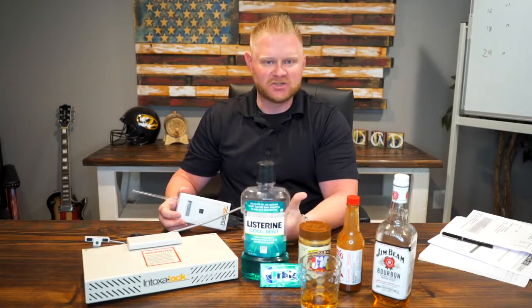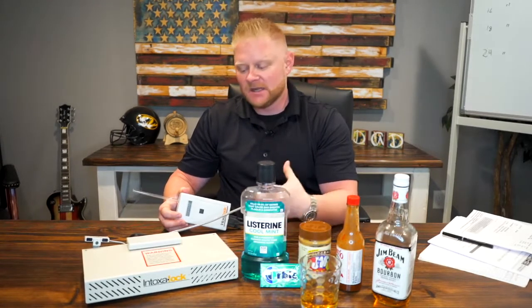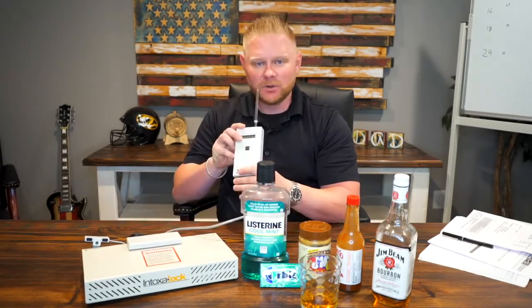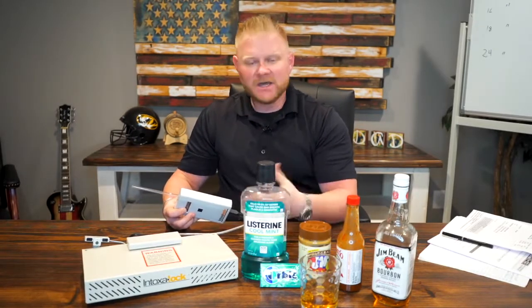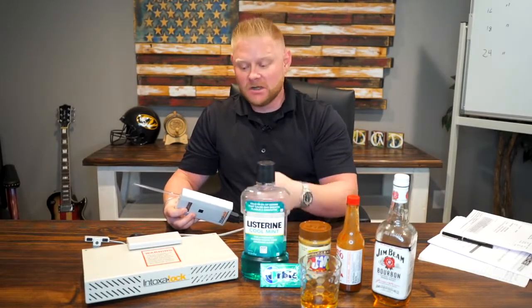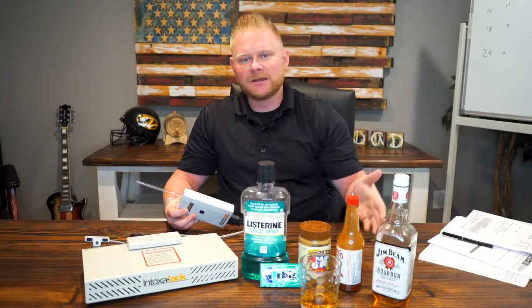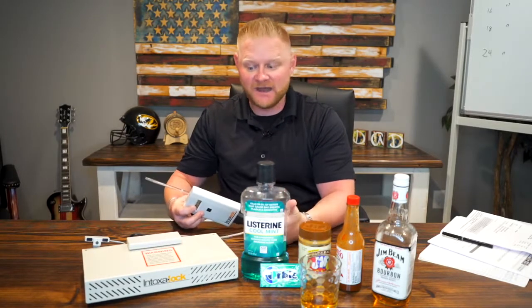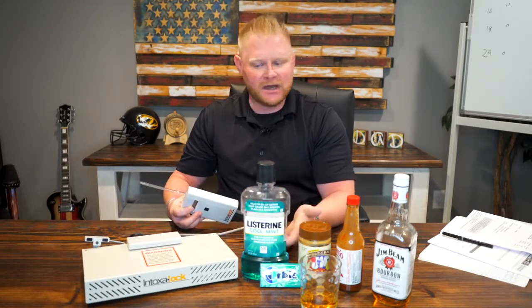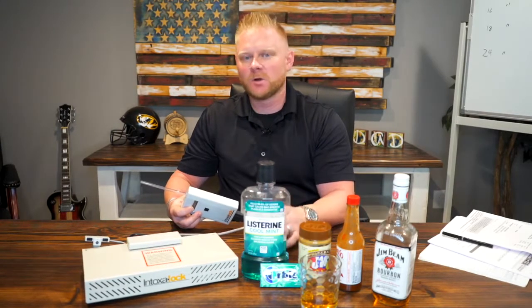What this does is it measures your blood alcohol content. If you read a certain blood alcohol content, then this device that you blow into will not start the vehicle. As you're driving the vehicle, there are systematic timeframes where you have to blow back into the device, hum into the device, blow into it — it's a little different based on the companies, but most of them are all the same.